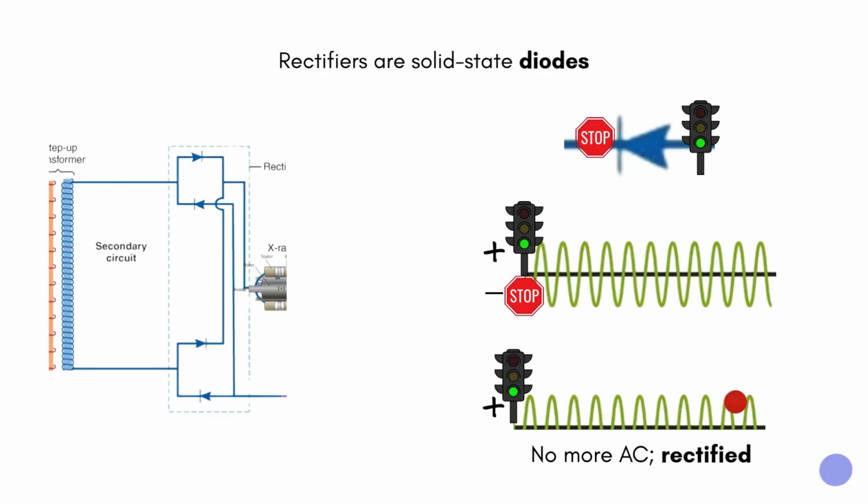And in fact, because of the arrangement of the rectifiers, what you usually get is the wave down here, instead of it being wasted and just disappearing, which we know can't happen, it's usually flipped up and put on this side. Regardless, when it's rectified, you have no more alternating current. You're not flipping that battery back and forth anymore. It's just still. It's just direct current up here on this side of the line.